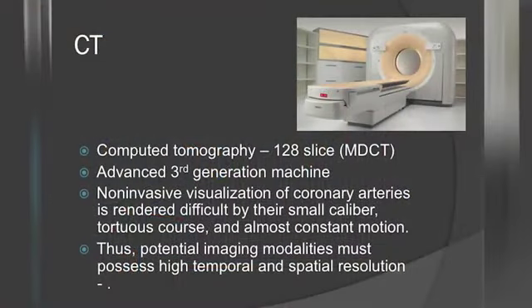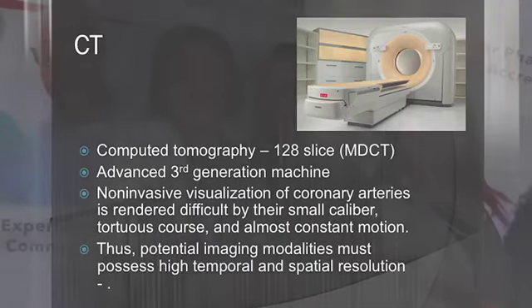The non-invasive visualization. So we'll come to what is non-invasive. The non-invasive visualization of the coronary arteries is very difficult, okay? Because the heart is constantly beating and these vessels are very small. They are tortuous, they are small, and they are in motion.